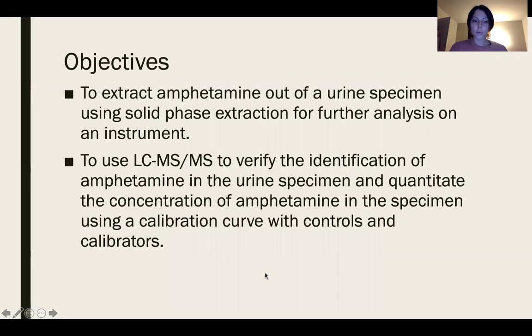So because there was a positive for amphetamine in the screening, one of my objectives is to extract amphetamine out of a urine specimen using solid phase extraction for further analysis on an instrument. That instrument I chose is LCMSMS to verify the identification of amphetamine in the urine specimen, and then to quantitate the concentration of amphetamine using a calibration curve with controls and calibrators.